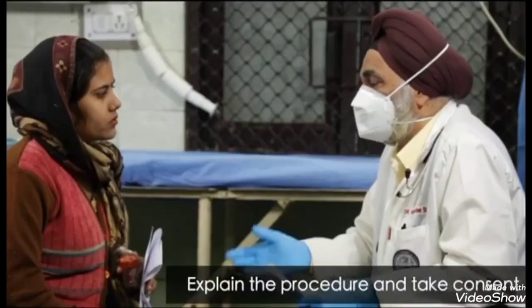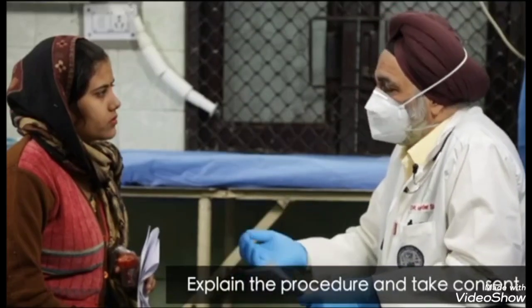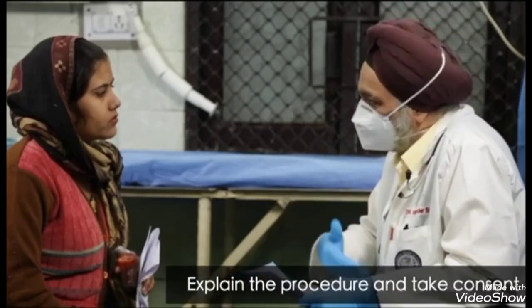We call this procedure either gastric aspirate, or sometimes, since the aspirate alone will not be enough to get the material from the stomach, we may have to put in some saline to lavage it. So it is also called gastric lavage. In this clip, we learn about gastric aspirate or gastric lavage. To begin with, explain the procedure and take consent from the parent or guardian.